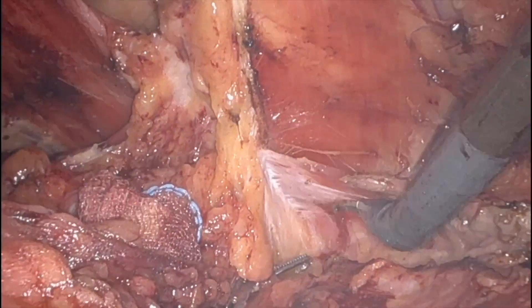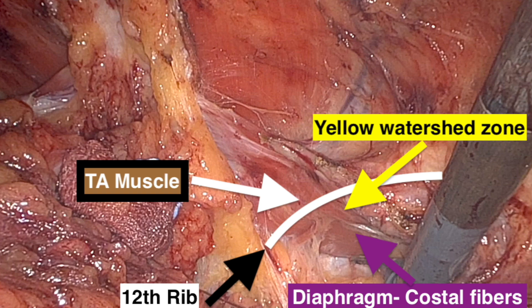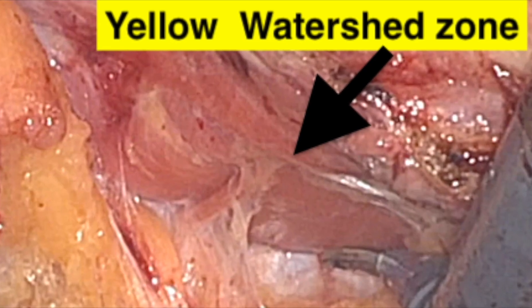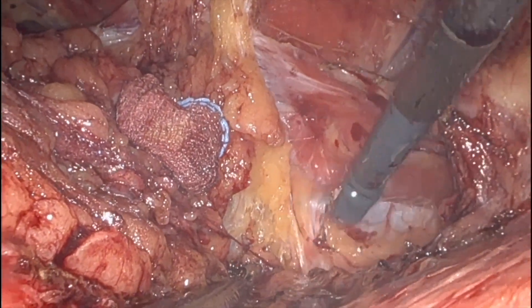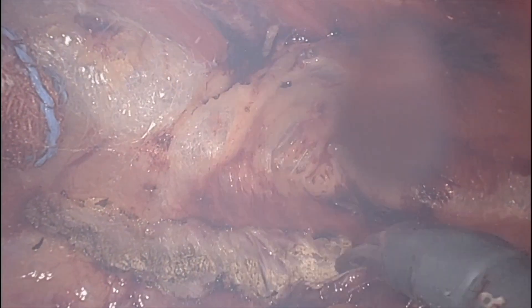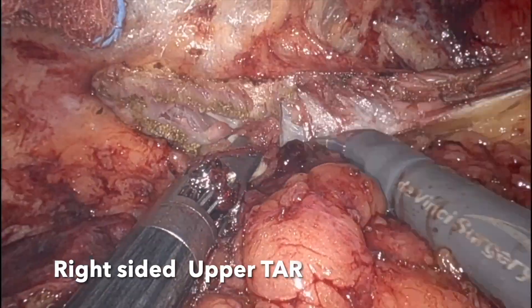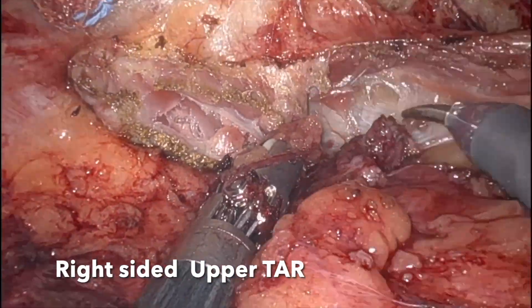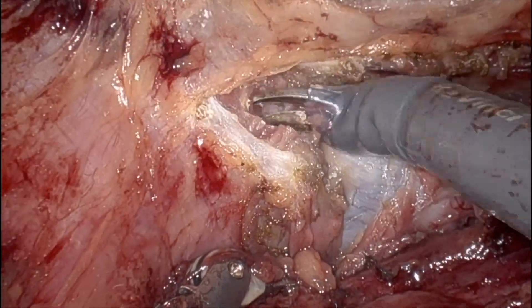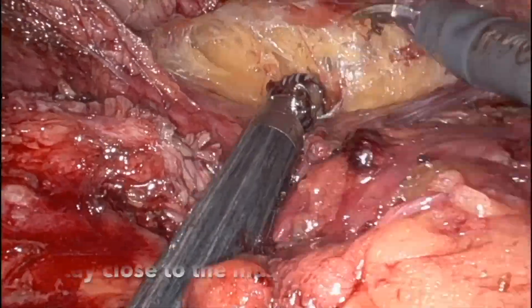The left transverse abdominus muscle was divided using a monopolar scissor. We then proceeded with a right-sided upper TAR. The posterior lamina of the internal oblique was incised, and then the transverse abdominus muscle was divided using a monopolar scissor on the right side as well.